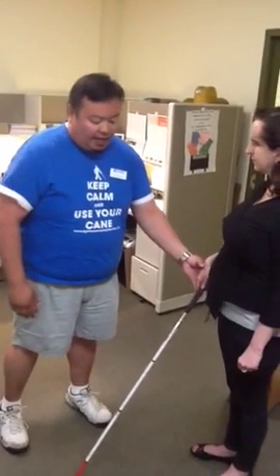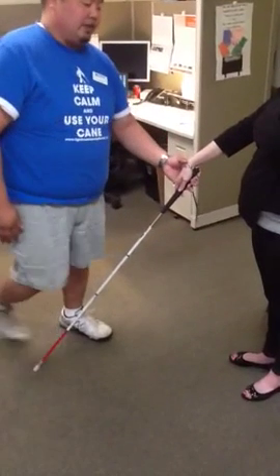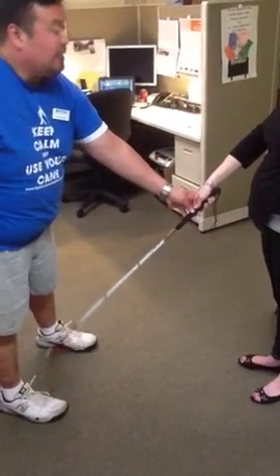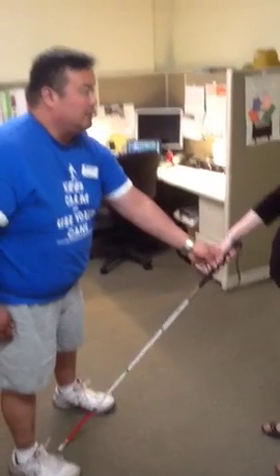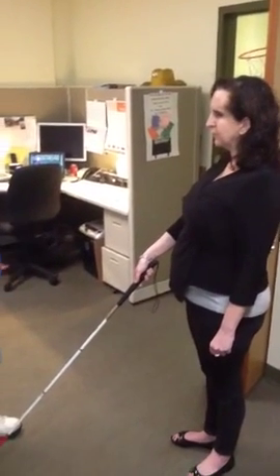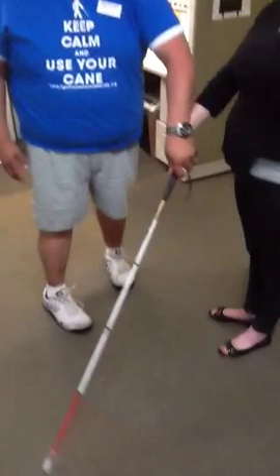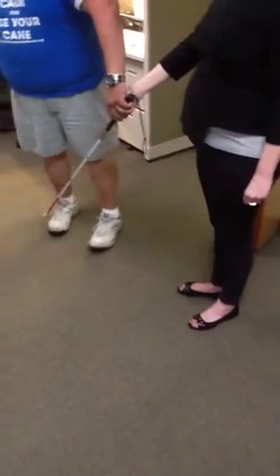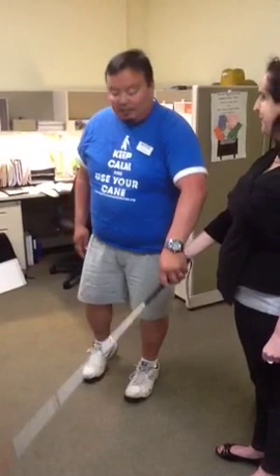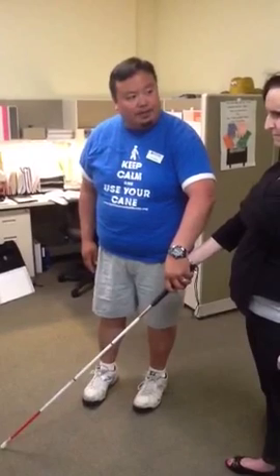When you use a cane, your cane is protecting everything in between your shoulders. So if my feet were shoulder length apart, this is the distance you have to travel with your cane. Why is that? It's because that's the width of your shoulders. It doesn't help that you move your cane here or all the way out here because it doesn't protect anything. All the cane does is give you information on potential things that could harm you here.